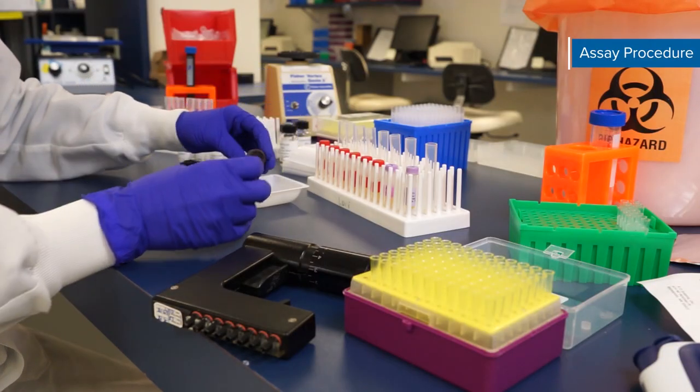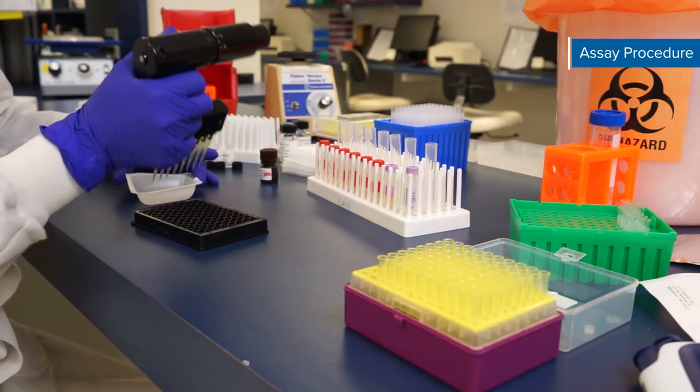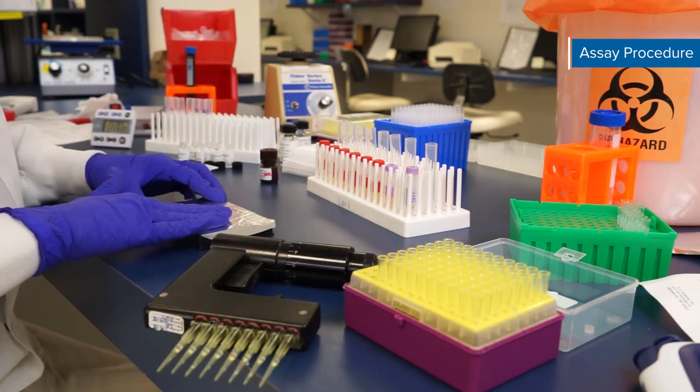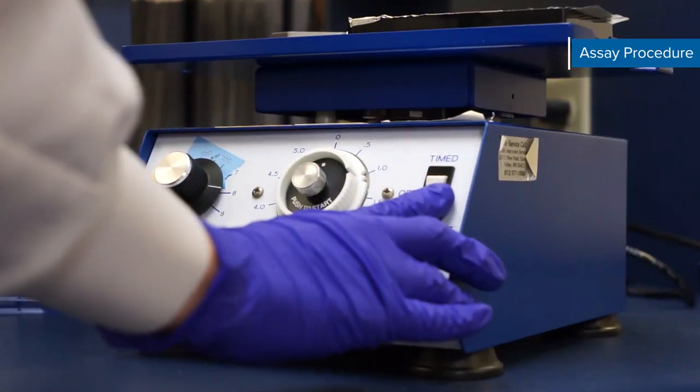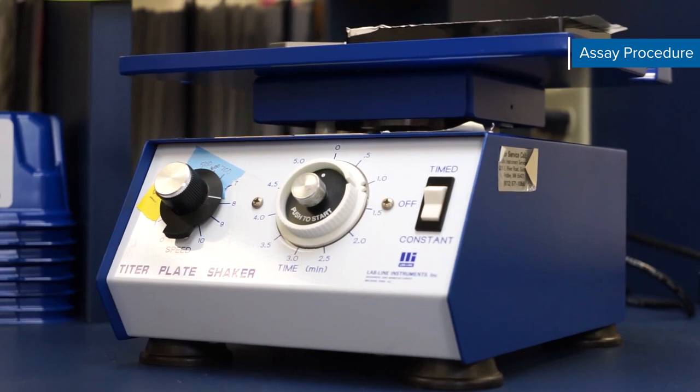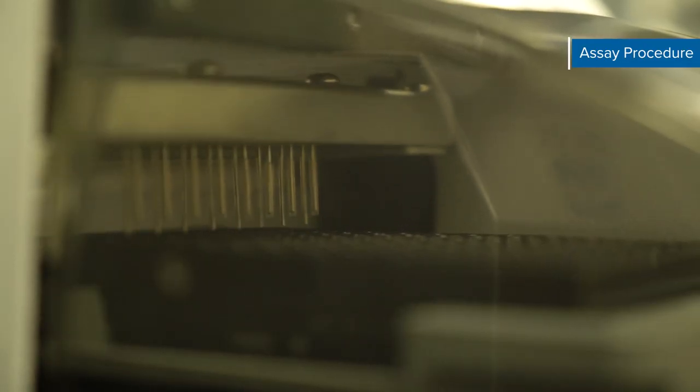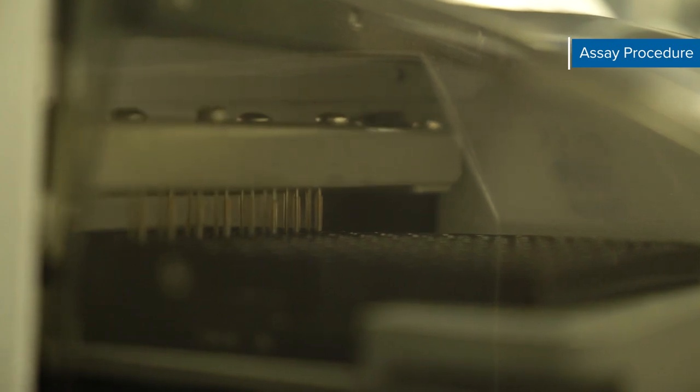Next add 50 microliters of diluted biotin antibody cocktail to each well. Securely cover with a foil plate sealer and incubate for one hour at room temperature on the shaker. After incubating for one hour repeat the wash step for a total of three washes. Again you may use an auto washer if you have one available.